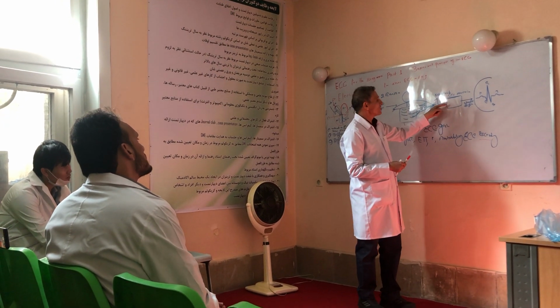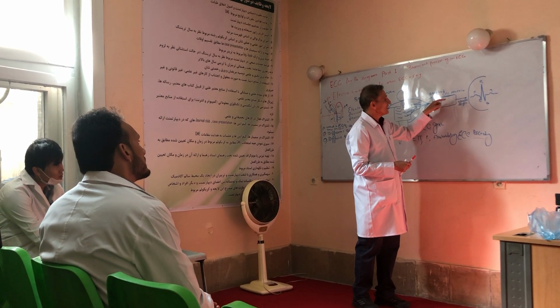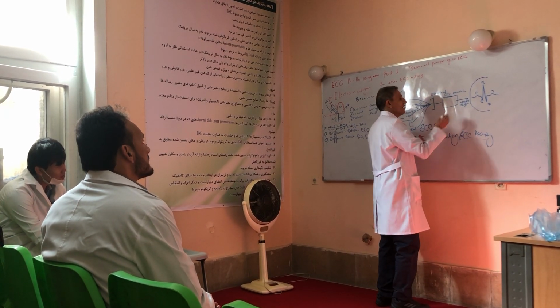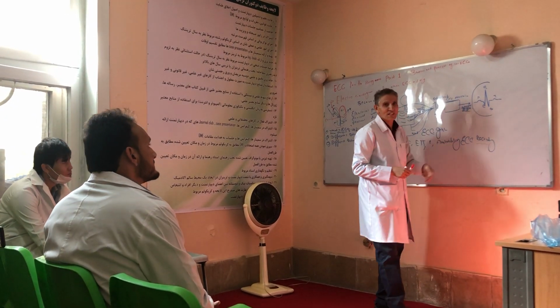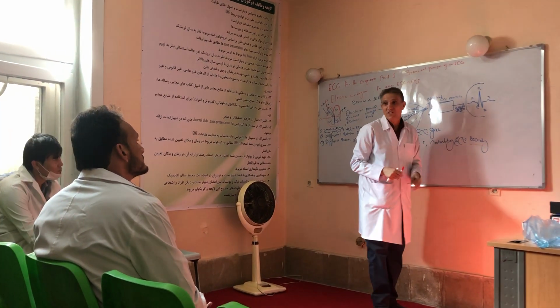Then in the ECG machine, this electrical force or electrical voltage or electrical impulse leads to deflection of this needle. This is the needle, or some people use the word stylus. It leads to deflection of the stylus of the ECG machine over the ECG paper and produces PQRST.